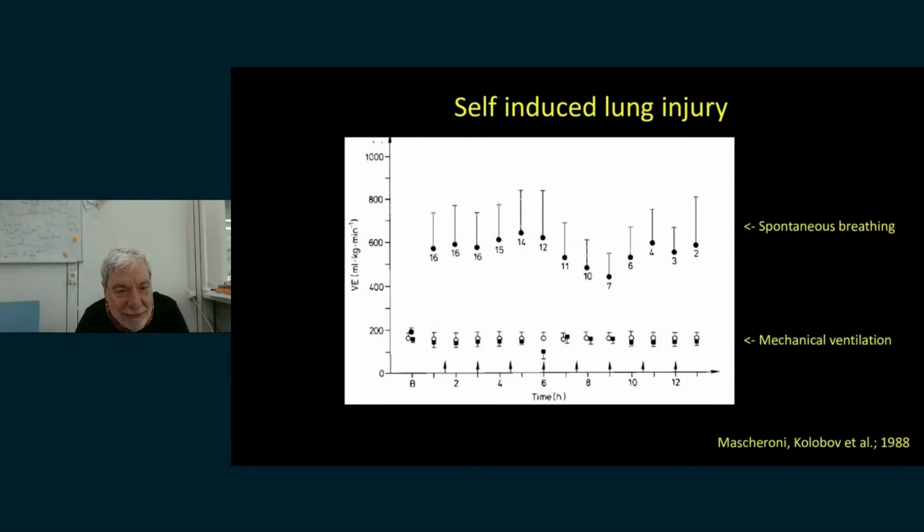But spontaneous breathing may be deleterious because it depends how much energy you put in the motor. I don't care if the energy is from the ventilator or from the muscles. The effects are increased stress and strain.